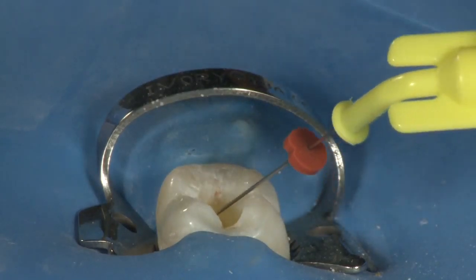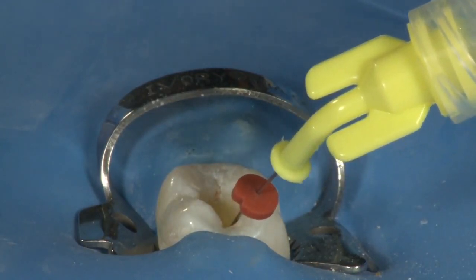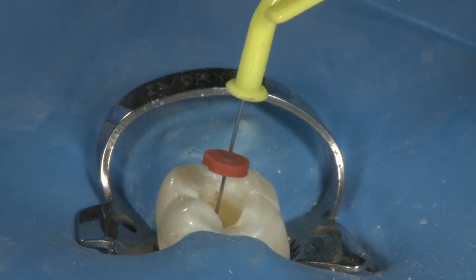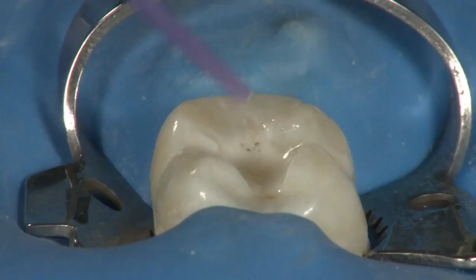Fill the canal with the liquid EDTA 18% and allow this to soak for 30 to 60 seconds. Where Chloracid is ideal for removing organic matter from the canal, liquid EDTA will break down inorganic matter such as the smear layer and expose the dentinal tubules.